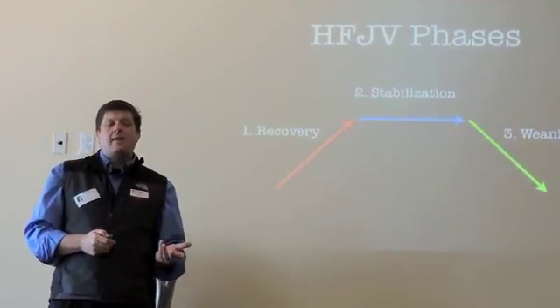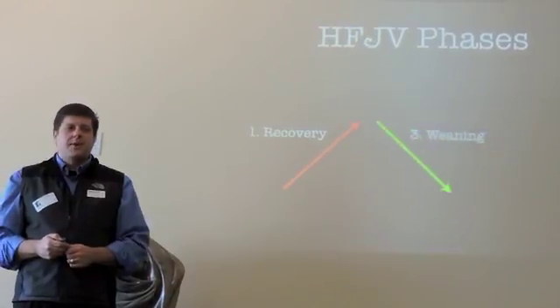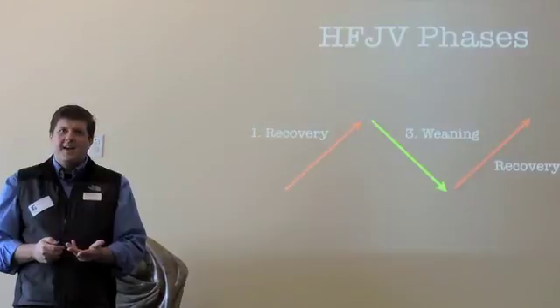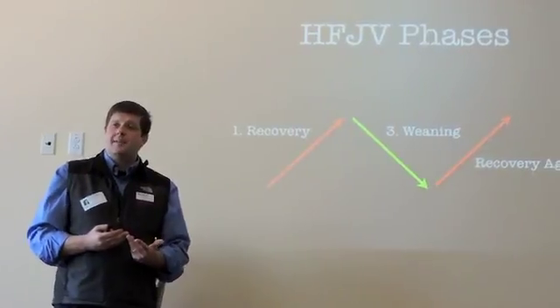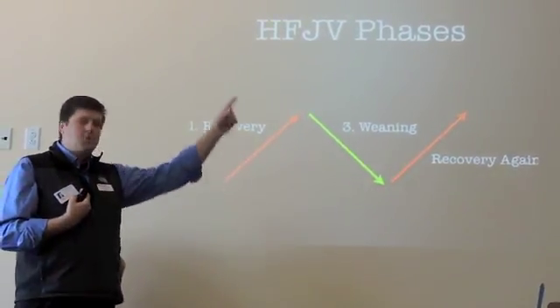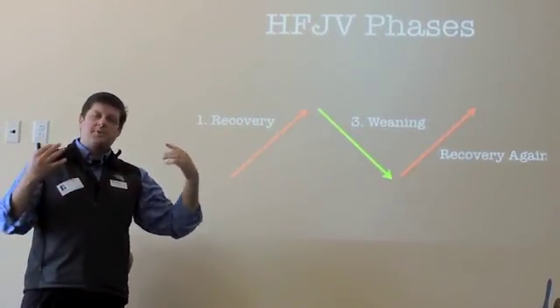And then you have the weaning phase. But all too often, we forget about stabilization, we go straight into weaning, which leads us right into recovery again. I'm all about trying to get the kid extubated quickly and sooner rather than later. But at the same time, sometimes my human impatience leads me into worse settings than I was before. So this is just one of those things to think about.